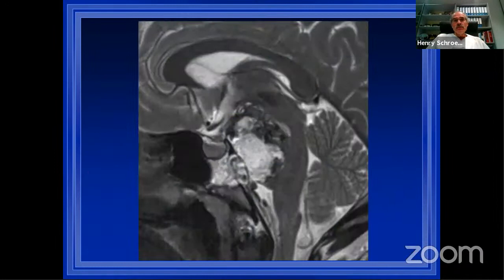So it's of utmost importance before you start with the surgery that you have an idea how you want to close a defect. For example, here, if you see this chordoma with clearly intradural growth, you know you have to make a robust reconstruction, otherwise you will have problems with continuous CSF leakage.